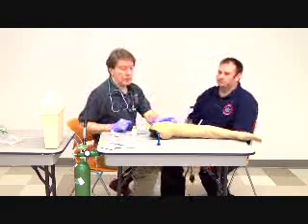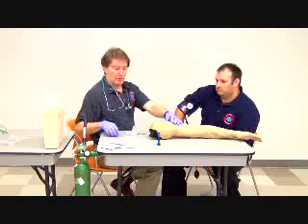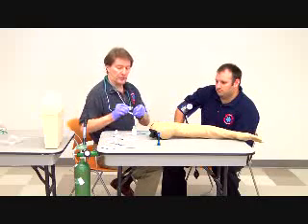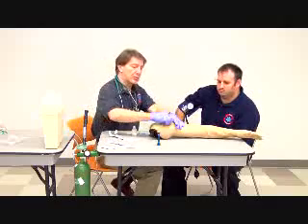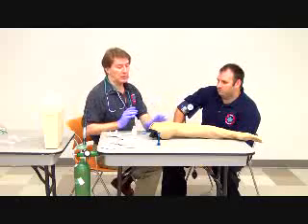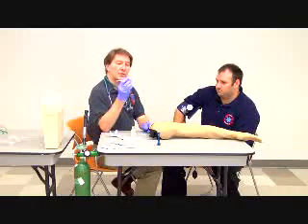Okay, so I'm next going to check my site and confirm that I can pinch up some fatty tissue. I'm going to take my alcohol prep, and in fact it's always a good idea to use a new alcohol prep for this. And I'm going to prep in a spiral motion from the point that I want to administer outward. Don't ever blow on this, don't ever wave your hand over it, just let it air dry a bit. And once it's air dried, I am going to uncap my syringe.